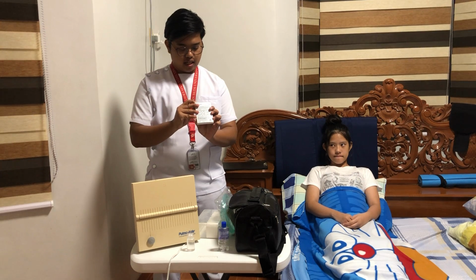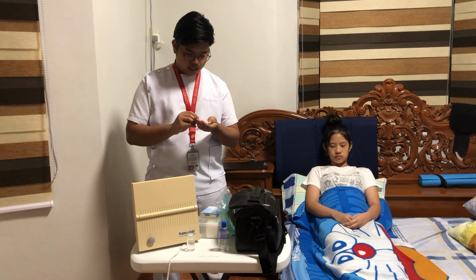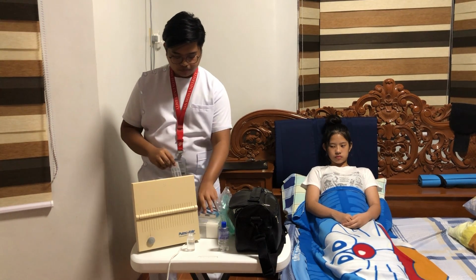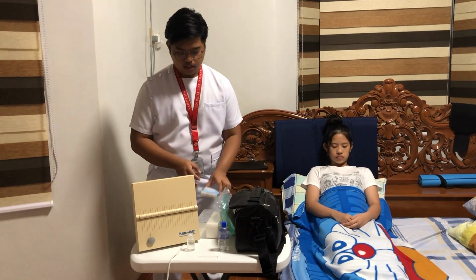And then after that, we also need to check the expiration date on the medication. It says here, December 2021. Double check on the inside. December 2021. In cases that our medication is expired, we need to return it to the pharmacy and obtain a new medication.